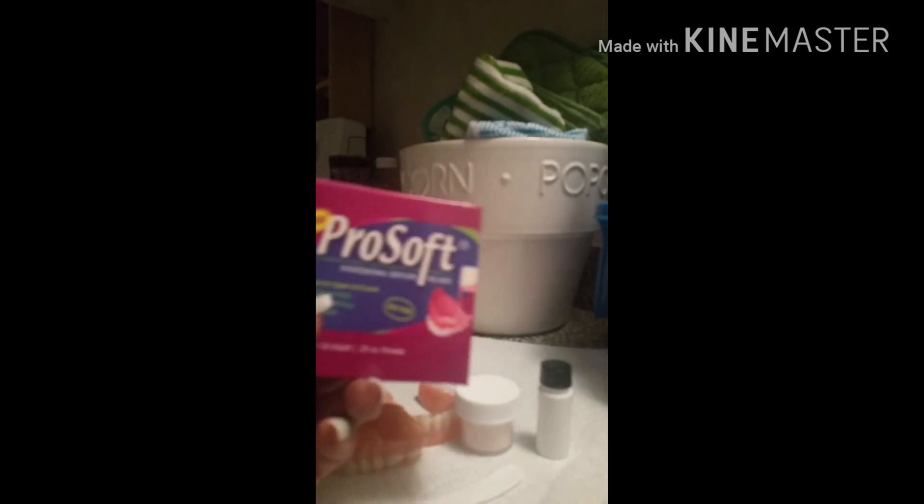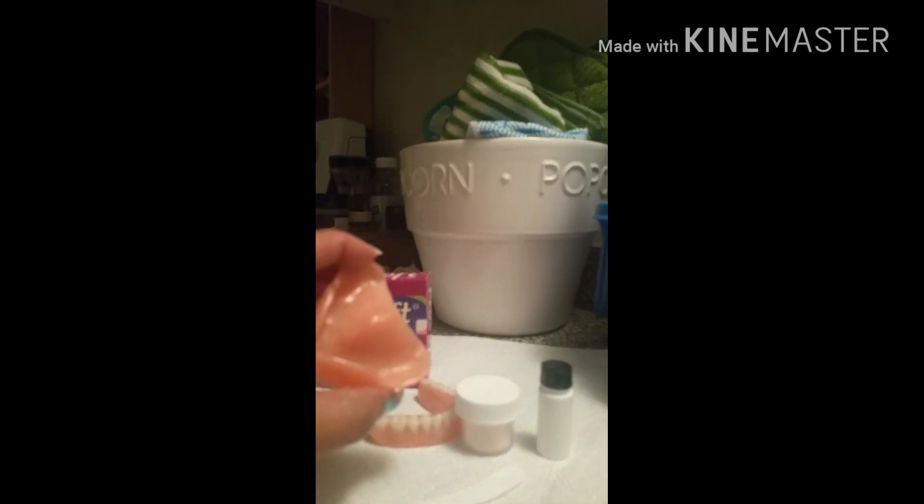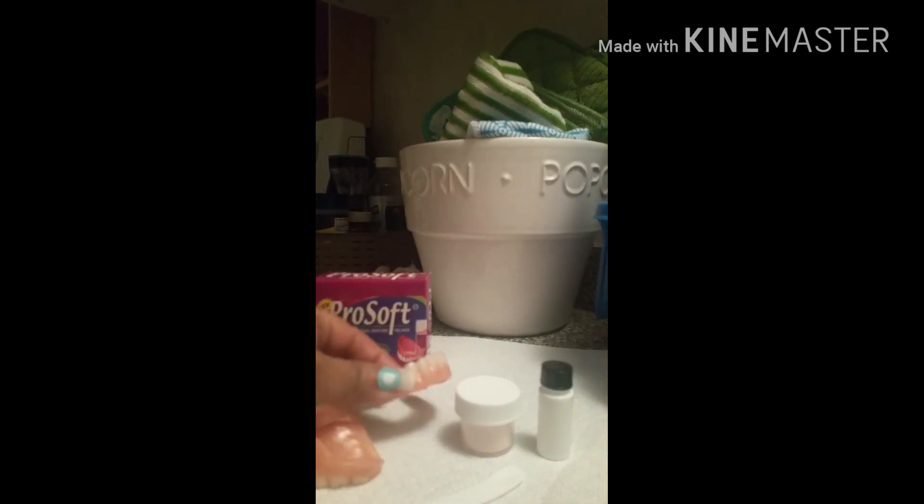Hello, Denture family and small buddies! What is up on this Monday — I hope everyone's doing good. This video is going to be about applying the ProSoft Professional Denture Reliner to my full acrylic upper as well as my acrylic lower.